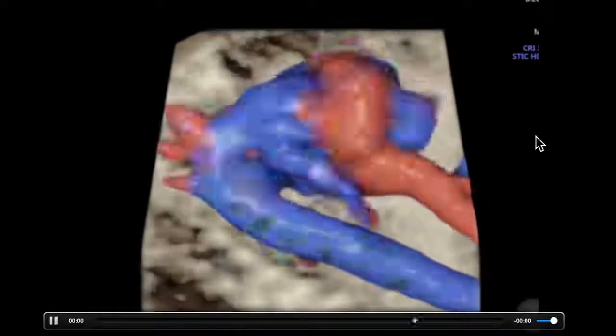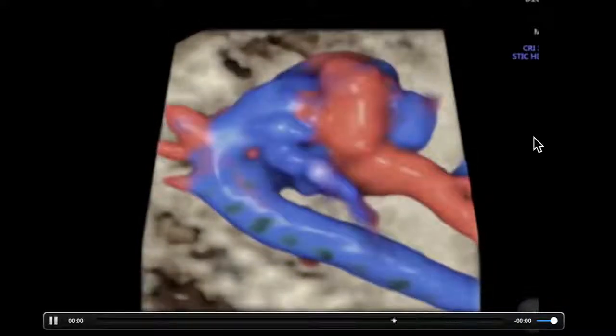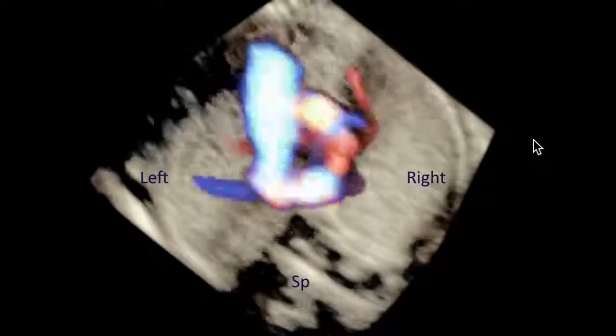Really, again, good depictions of things like aortic arches, where vessels lie relative to chest, relative to lungs, relative to diaphragm. So again, highlighting some of the beauty of rotation and using these images to your benefit.